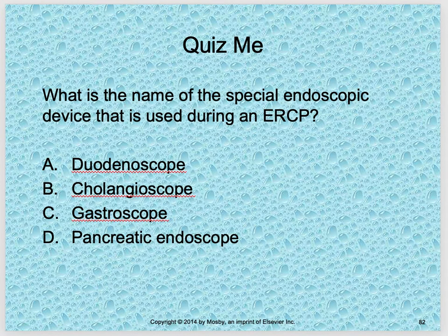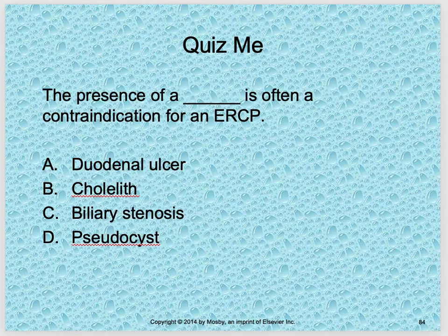So what is the name of the special endoscopic device that is used during an ERCP? I just showed you. Is it a duodenoscope? Is it a cholangioscope, gastroscope, or pancreatic endoscope? And I showed it to you, so it's the duodenoscope. It's used during the ERCP.